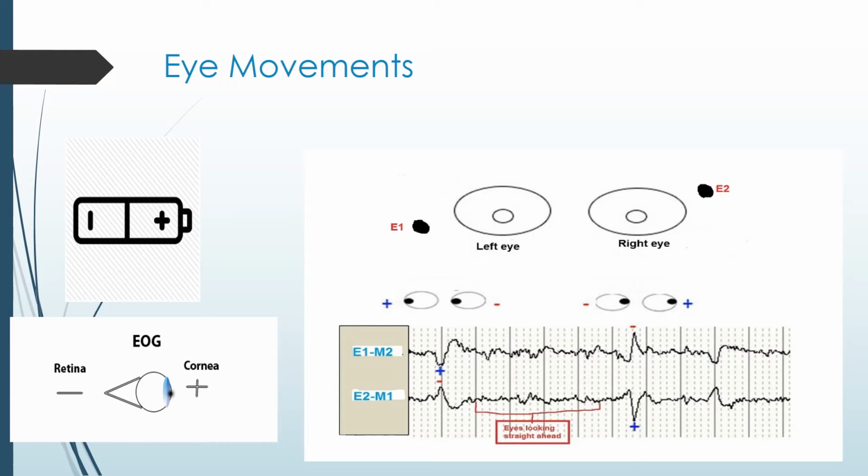This is making a positive deflection. See the plus mark on your tracing? And see how the line dipped down. Okay? Now keep staying on that top line and let's go over to the next one.